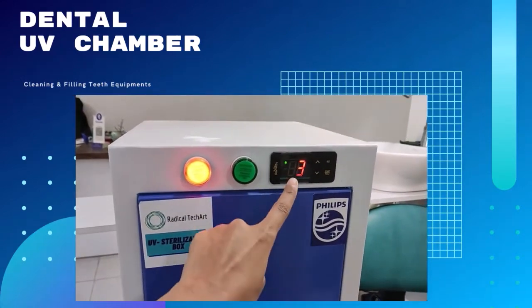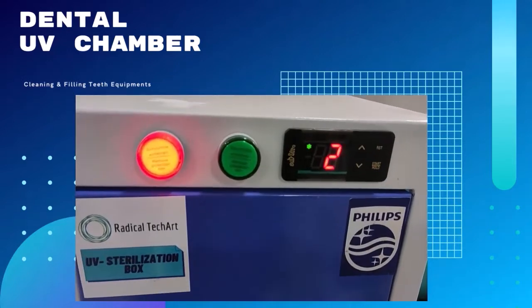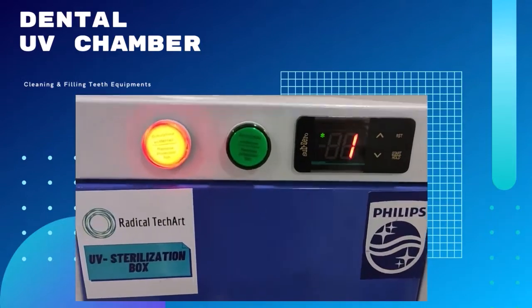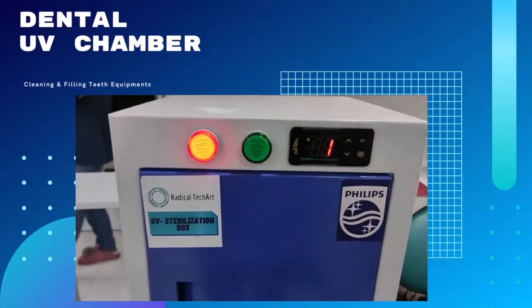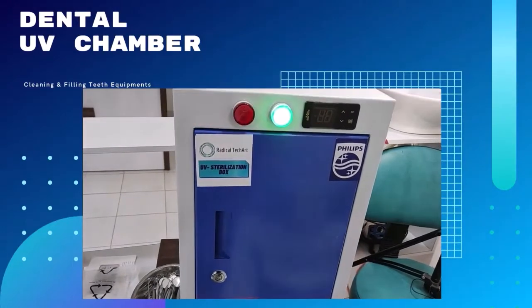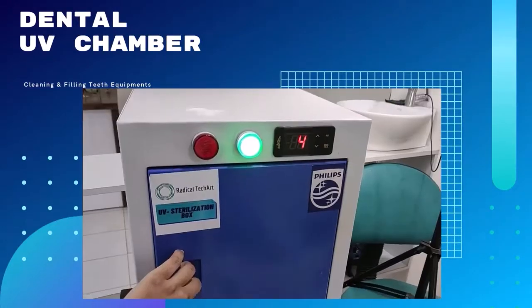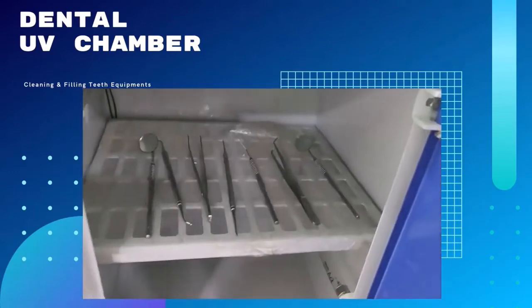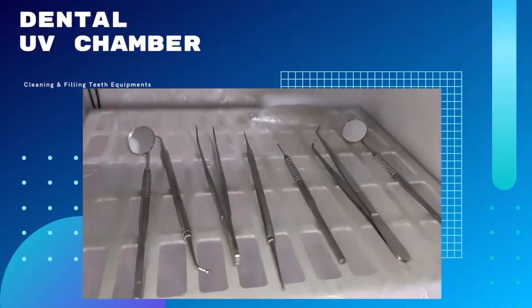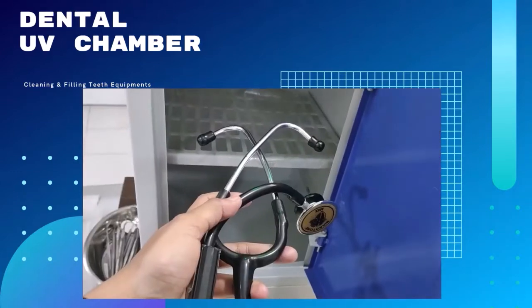Now I again wait for this timer to be stopped. One more minute is left to clean this instrument. Now you can see the green light and the machine is stopped. You can see the cleaned instruments. This is the whole process of the UV sterilization chamber working.